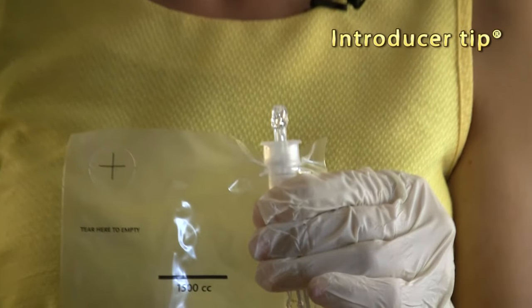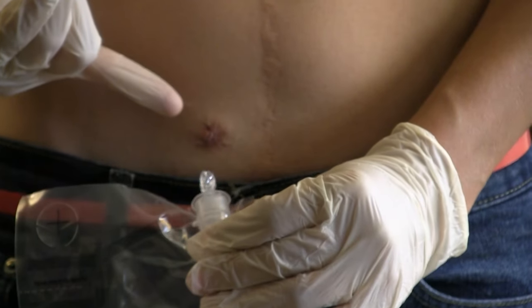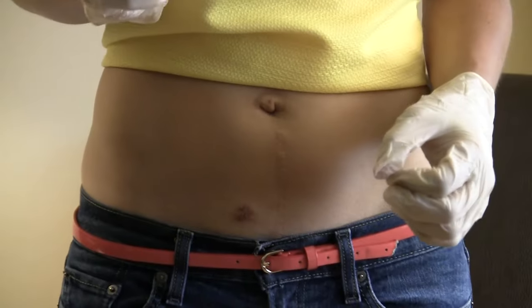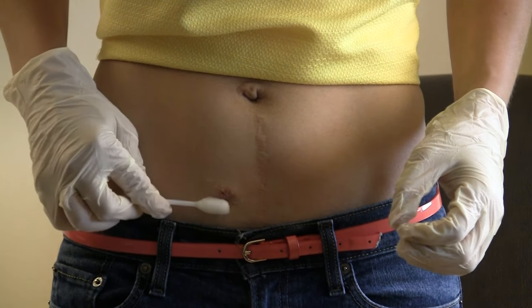This is the introducer tip that helps protect the sterility of the catheter. When I'm ready to catheterize I'm going to insert the introducer tip and the catheter to my stoma. Before I catheterize I need to clean the area around my stoma. I'm going to use the three swab sticks, all three of them, one time around my stoma to keep the area clean.